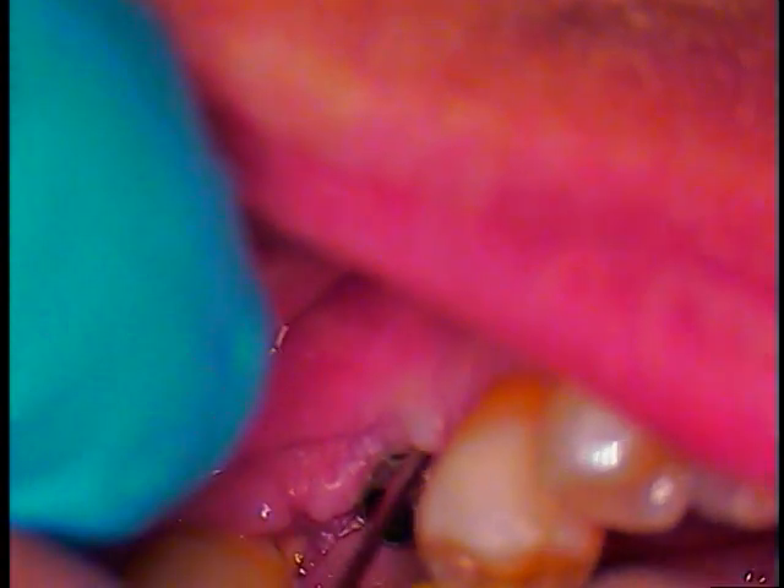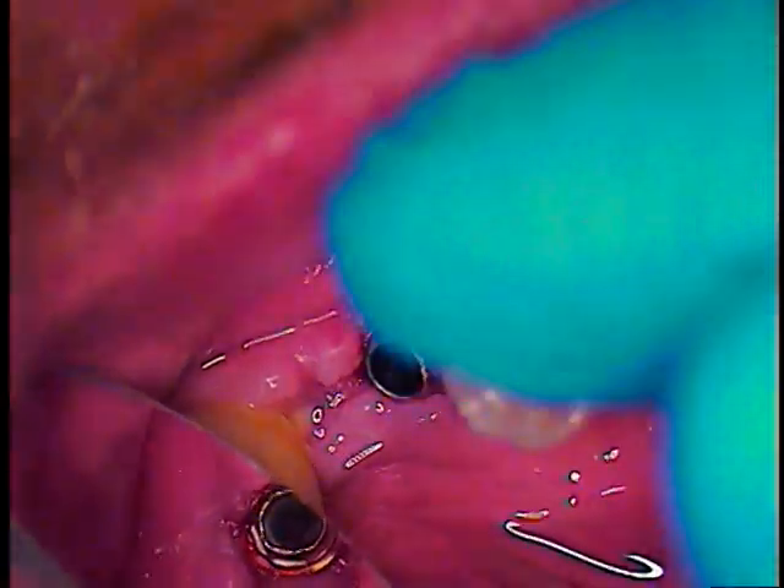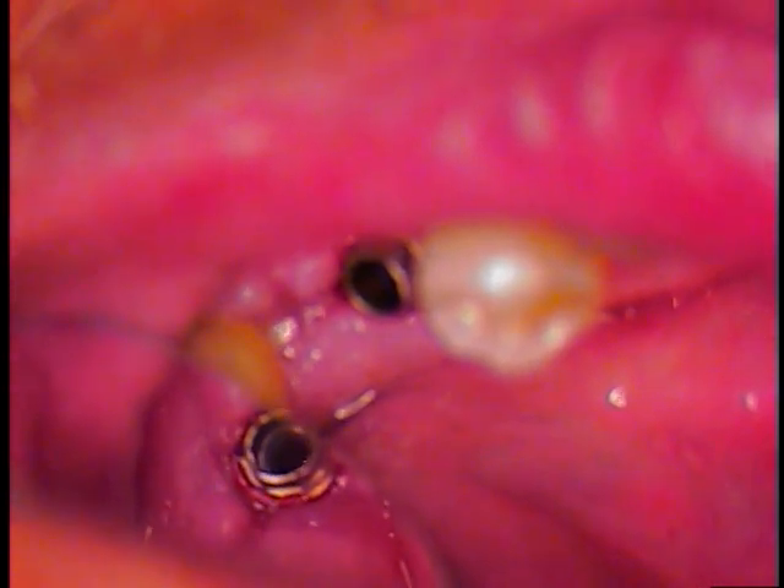We've got to suction around it and see what's going on. We need to look down in the shaft somehow — let's try that next. We'll need the long explorer. This will tell me if it is the abutment and everything — I'm going to get real close to it.